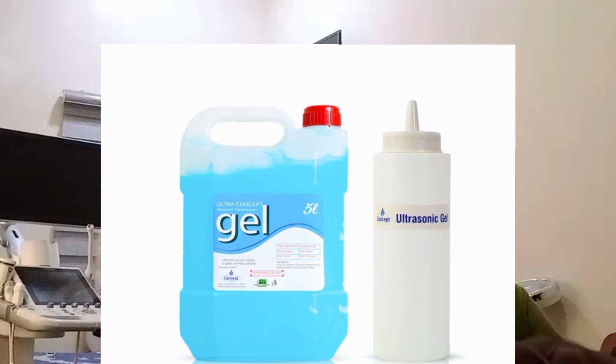Coupling gel, our famous gel. Everybody uses a gel, so let's look at it. Coupling gel, or acoustic gel, has an acoustic impedance between those of the matching layer and the skin. What did you notice? Everything in between the transducer itself and the patient's skin has an acoustic impedance that is in between these two materials.